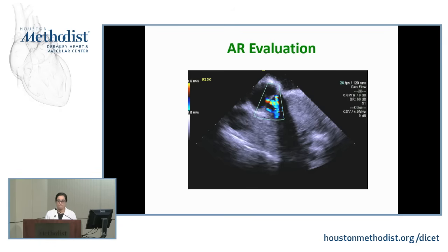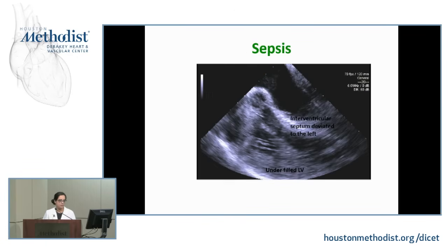Then CT can help, but the question is whether the kinks are relevant or not. The aortic anastomosis, if you go to a surgeon, thankfully no surgeons in the room, they'll never accept that it is something that's causing the problem. So the CT is helpful, this is helpful, but putting a pressure catheter through here, like doing an FFR, just nails it, that proves your diagnosis.